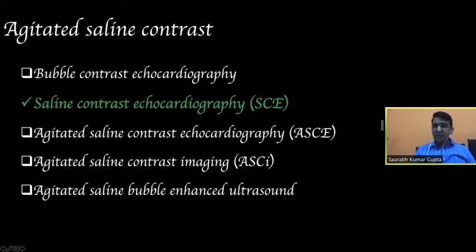Now, there are various terminologies which can be used for this kind of echo imaging. As you can see, I prefer saline contrast echocardiography because it tells us about the medium and what imaging modality has been used.